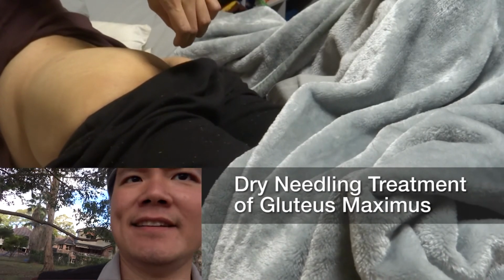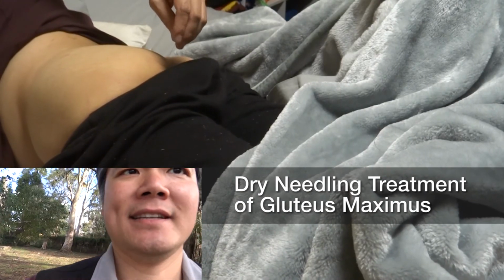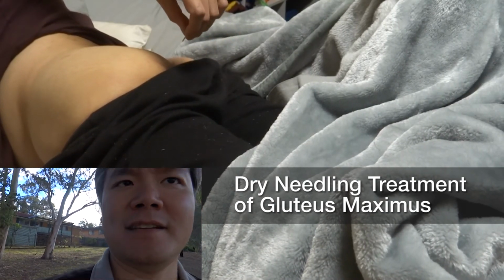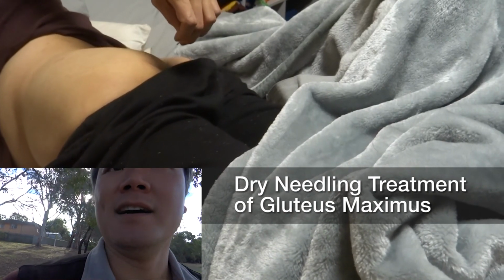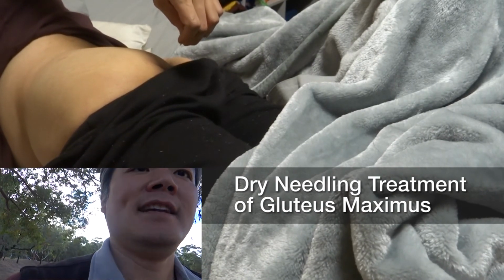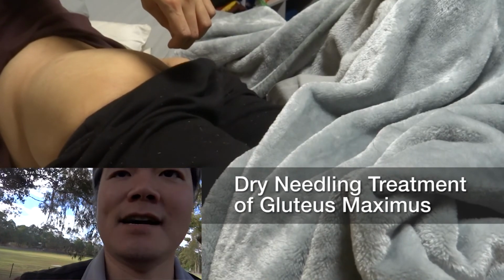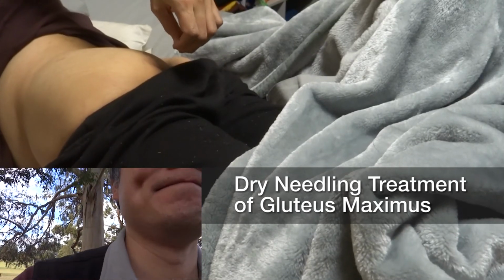This stimulates A delta nerve fibers and consequently releases opioid peptides from interneurons in the dorsal horns. These peptides counteract the effects of algogenic substances and thus produce what I call a neurogenic reset of the kinetic pattern. Needles are left in place for about 10 minutes. After removing the needles, we should follow up with exercises to correct the kinetic pattern.